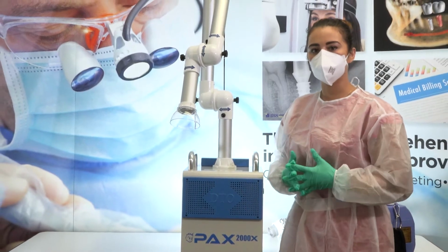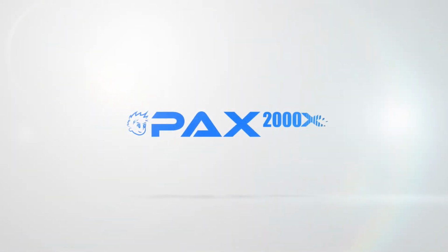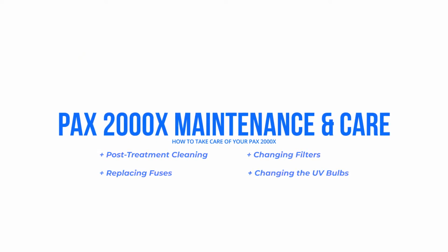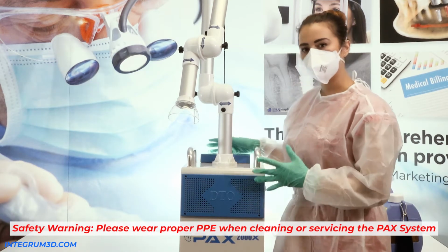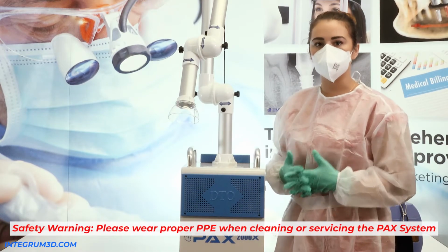So now we are going to go over the maintenance and care of the PAX 2000X. While maintaining and caring for the PAX 2000X, be sure that you are wearing the proper PPE while doing so.